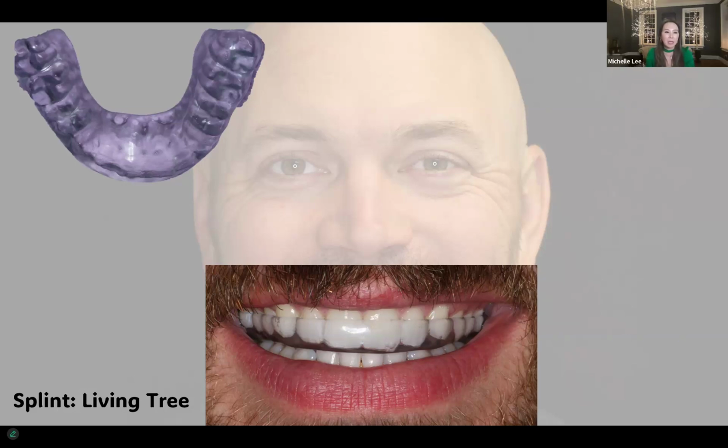And obviously, even before I could say anything, he was like, all right, Dr. Lee, what do we need to do to protect my dentistry? I'm like, I'm so glad you asked. So I make him an upper splint. 90% of my splints are on the lowers, but in this case, I felt I could satisfy as many buckets for him as I could by making him an upper one. So we now call this a bite protective appliance, a muscle relaxation appliance, and a joint protective appliance, all three things in one appliance. And I said, please just wear this at night and please protect your dentistry.